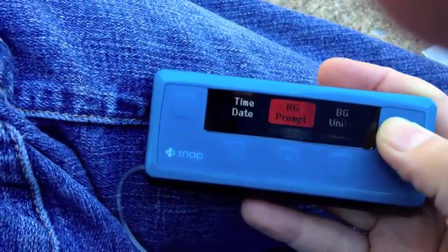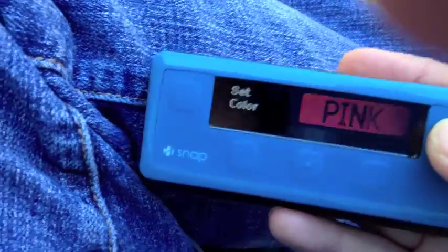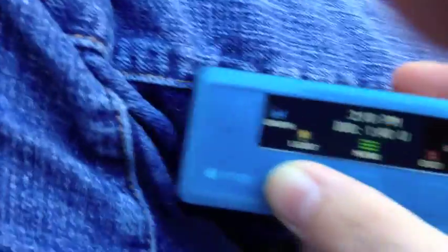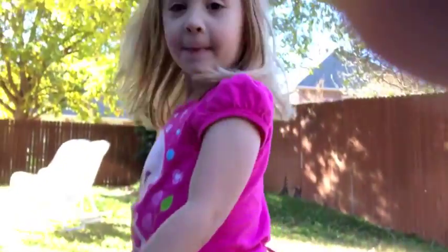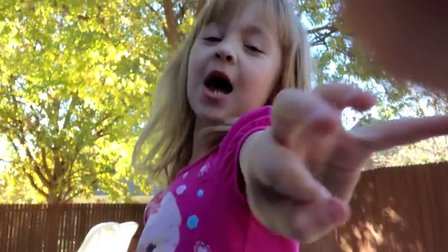Let's change the color just to be fun — we're going to go pink. With the help of my children, the unboxing of the MySnap. Less prep time, more life time.